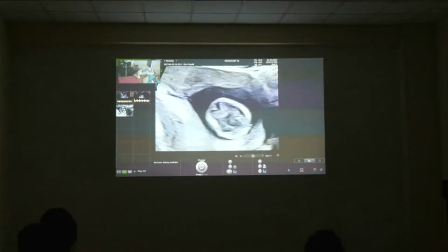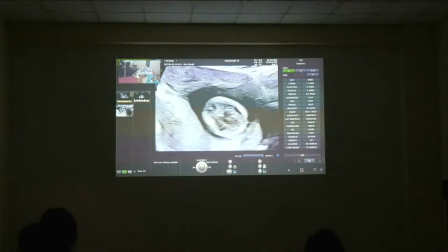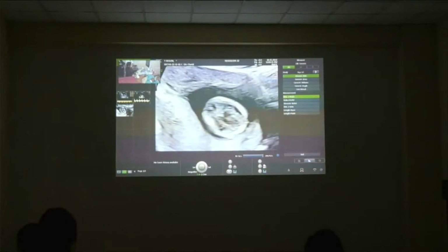We go a bit down, we document the thalami. The two thalami out here, and the third ventricle is in between these two thalami. And even at this point, we have to document the BPD because these are certain measurements you have to take if you are using the FMF software, which is given by the FMF UK Foundation. So the BPD is showing 12 weeks, 5 days.